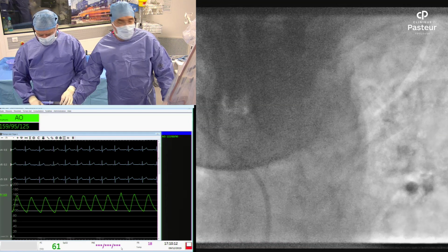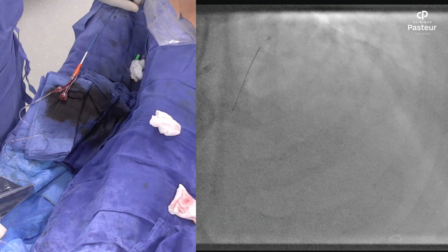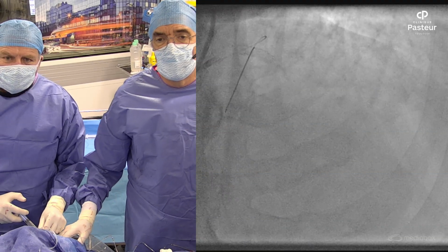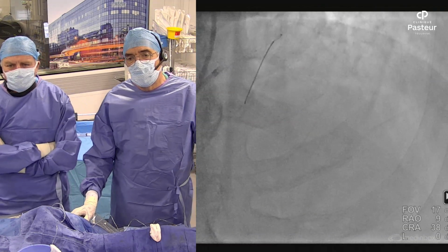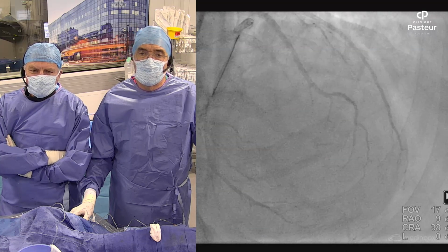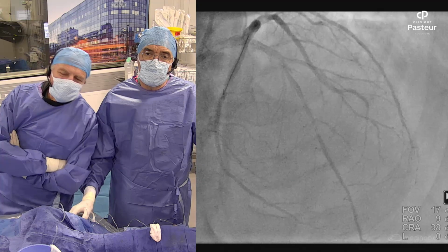Absolutely. I think the left main and proximal LAD, proximal circ is perfect with the stent technique. Then, of course, we have this problem of the mid LAD, which was a little diseased. But I think it's stable. It's correct. It was like this at the very beginning. Yeah, it's a long disease. And if you want to stent the mid, then you have the distal plaque also. So the left main is good.